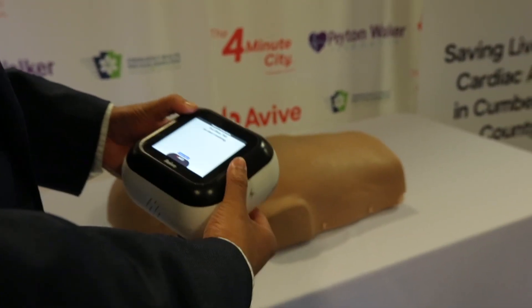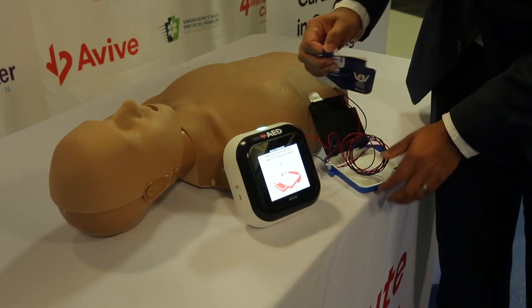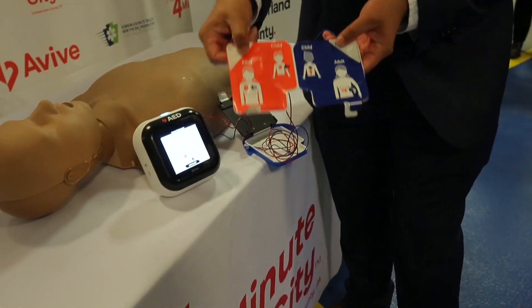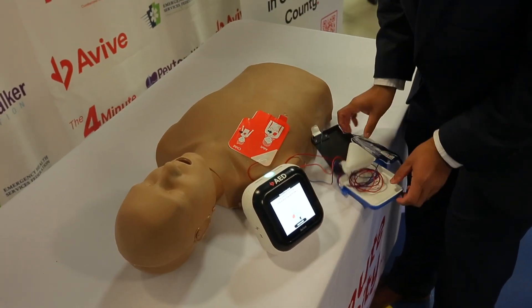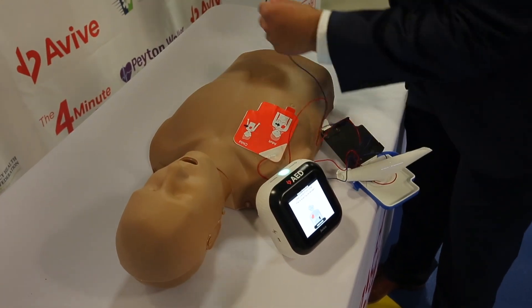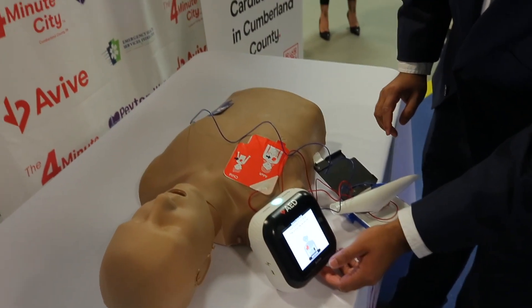Pull the tab to start training. Once the patient's chest is exposed, open the package you pulled from the device and take out the pads inside. These are the electrode pads that you would place on the patient. Look at the picture on the red pad. Peel off the red pad from the white liner and firmly stick on the patient's bare skin, exactly as shown. Then peel off the blue pad from the white liner and firmly stick on the patient's bare skin, exactly as shown.